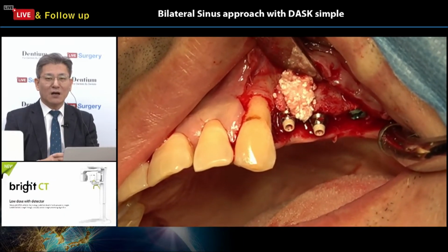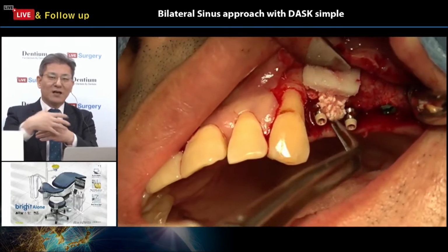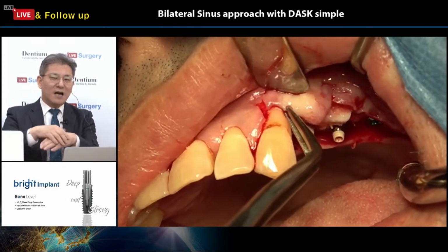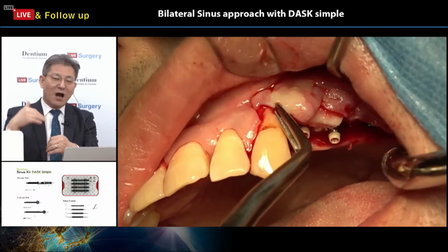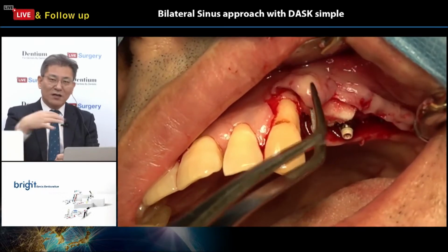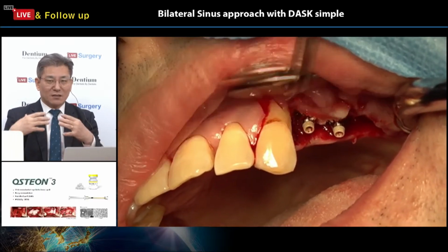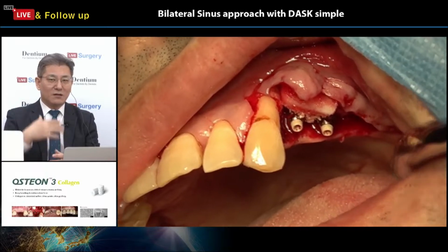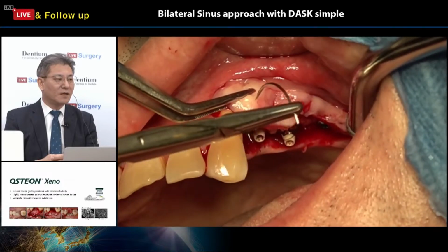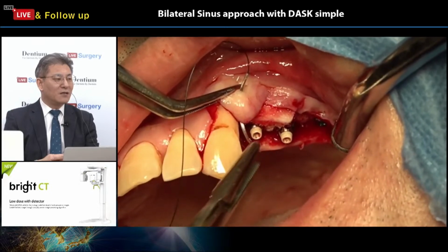This one is actually alloplastic graft materials. The autogenous and alloplastic combination is getting a better outcome. The inside of autogenous has higher properties, high potential to make new bone formation. The outer layer of osteon collagen, alloplastic bone, gave us the performance of the volume maintenance, right? And after that, the collagen graft is applied here instead of collagen membrane.